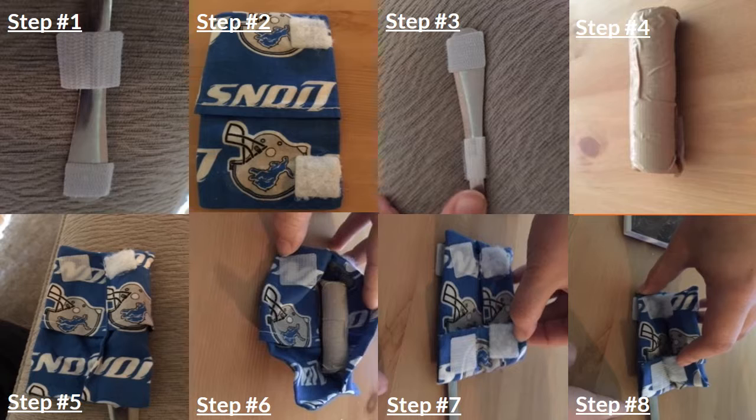Step 1. Apply 2 Velcro squares to the eating utensil. The first strip should be near the top of the handle, and the second strip should be placed about 2.5 inches under the first strip. Step 2. Hot glue the other 2 Velcro squares to the fabric. Step 3. Trim the Velcro squares as needed to increase the aesthetically pleasing design of the product and decrease potential irritation. I trimmed the second square to make it curve naturally into the spoon because that Velcro can be a little rough and we wouldn't want it to annoy our clients' hands while they're trying to enjoy their yummy meal.